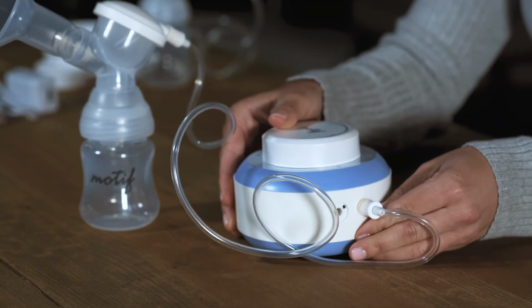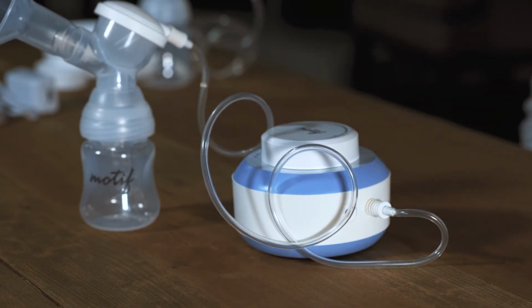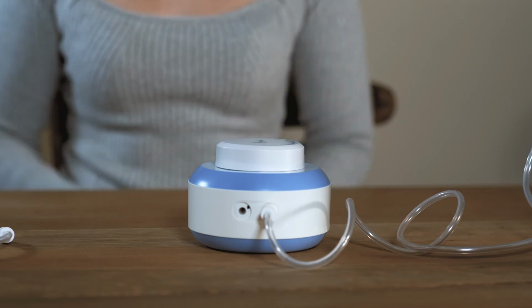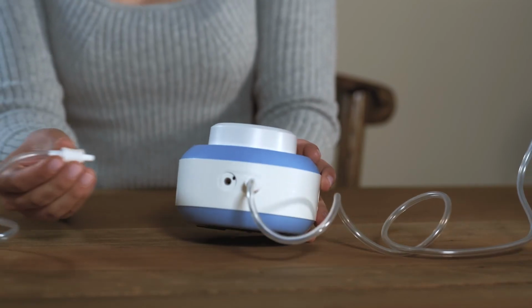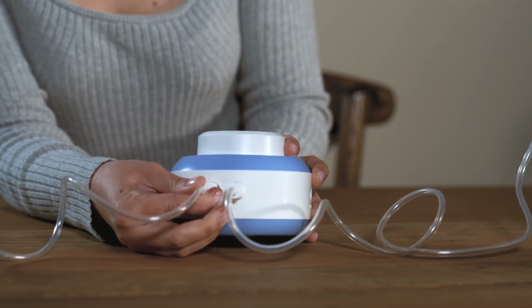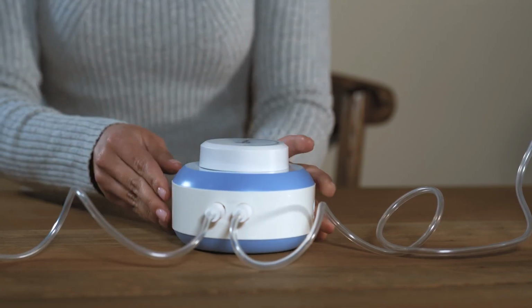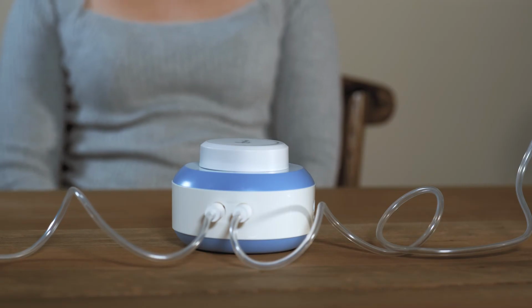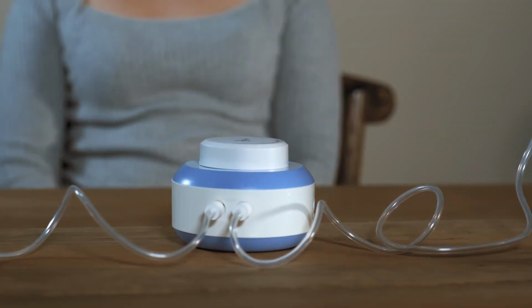While single pumping, make sure to insert the tubing connector into the port on the right side of the pump body. Do not use the port on the left with the black button, or you may experience suction loss. To use the Motif Twist in double pumping mode, plug both of the tube connectors into the ports and make sure that the black button in the left port is completely held down by the tubing connector, as this will allow suction on both sides of the pump. You are now ready to begin your pumping session with the Motif Twist.